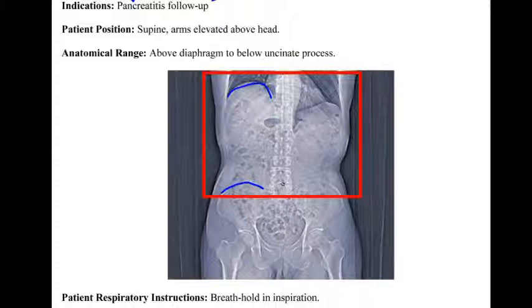If we go by what we're seeing on the scanogram, we've got L5, 4, 3, 2, 1, T12, T11, 10, 9, and then we've got 8 situated right up here. Usually, it's an accepted fact that the head of the pancreas sometimes lies around L2.